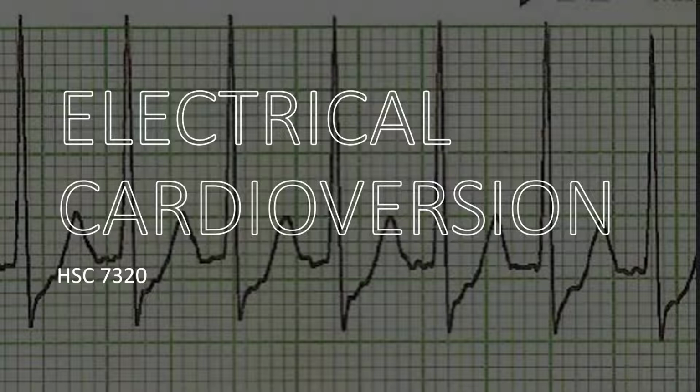The main differentiation between cardioversion and defibrillation is the use of a synchronized delivery system. The synchronization is an automated function of the defibrillator that ensures that the shock is delivered during the non-vulnerable portion of the cardiac cycle. In other words, it ensures that the shock is going to be delivered to avoid the terminal part of the T wave. This avoids this depolarization wave from occurring during the relative refractory period where it might initiate further VF or VT.